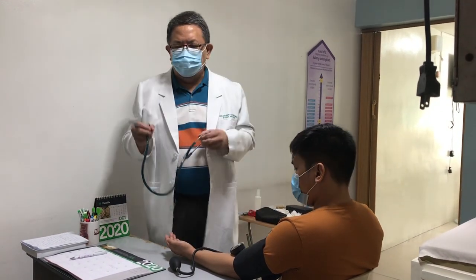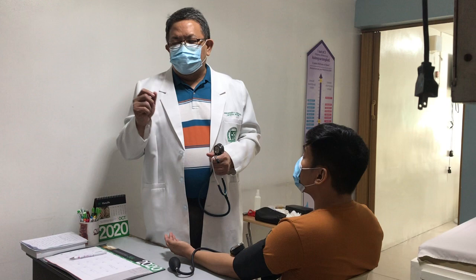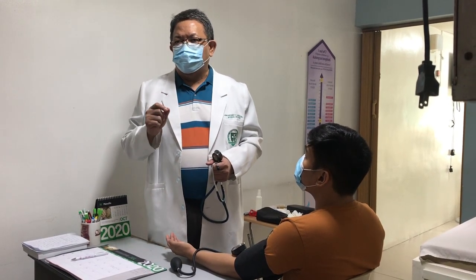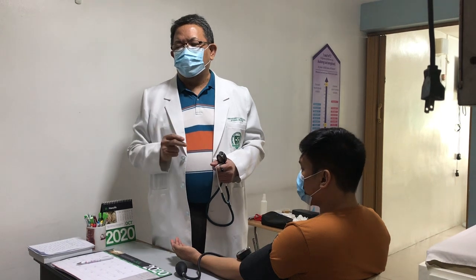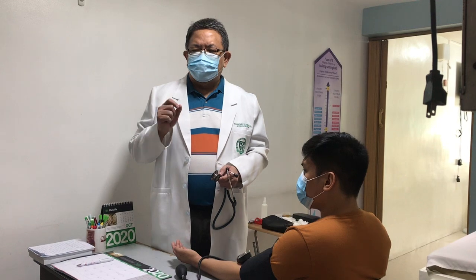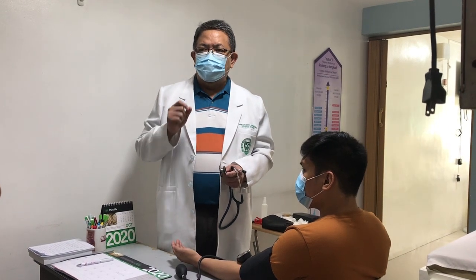For the stethoscope, the sounds that we listen to when taking blood pressure are the Korotkov sounds. Korotkov sounds are low frequency sounds, so the best part of the stethoscope to use is the bell.